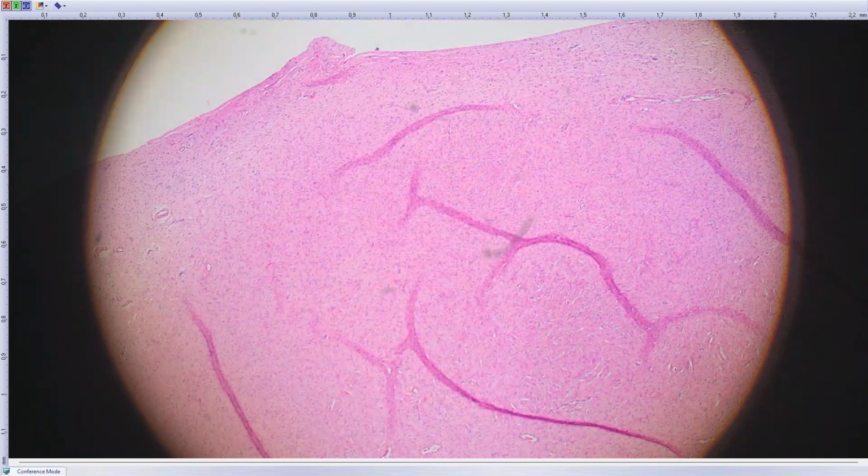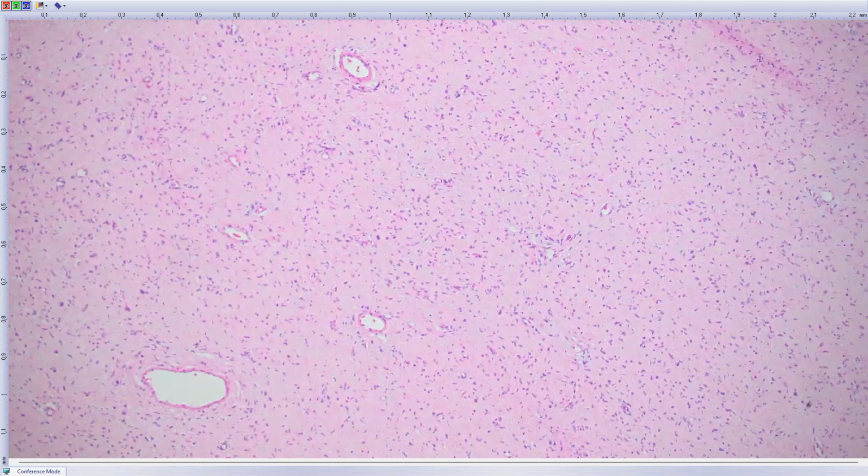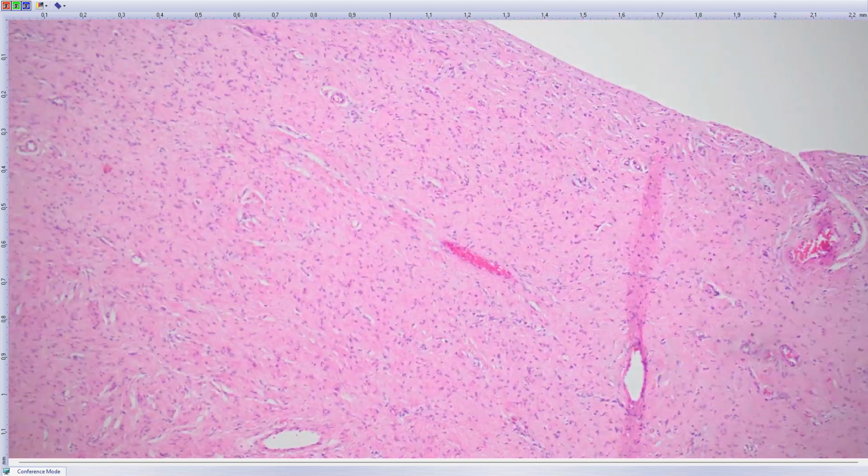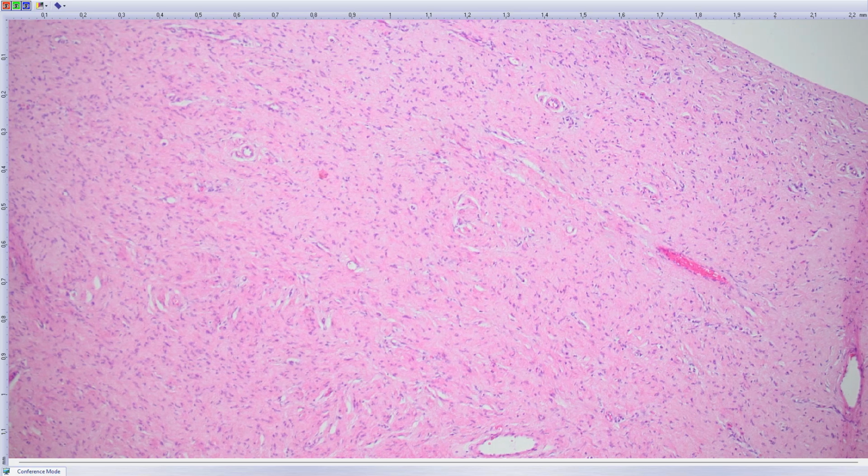Okay, next case. This was a 70-year-old female with a tumor around her elbow. And this was an oval, sharply circumscribed, again, spindle cell tumor. It looks like they basically shelled it out of the soft tissues. And this is Tomáš, this is from you. You brought it. And so you can see a quite hypocellular spindle cell lesion.